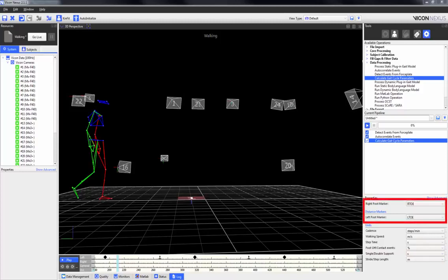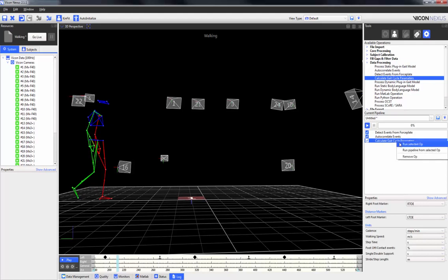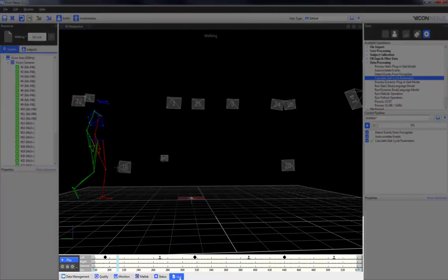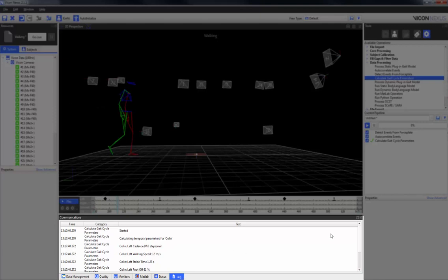The left and right markers can also be selected. Once the operation has been run, you can find the parameters in the log window.